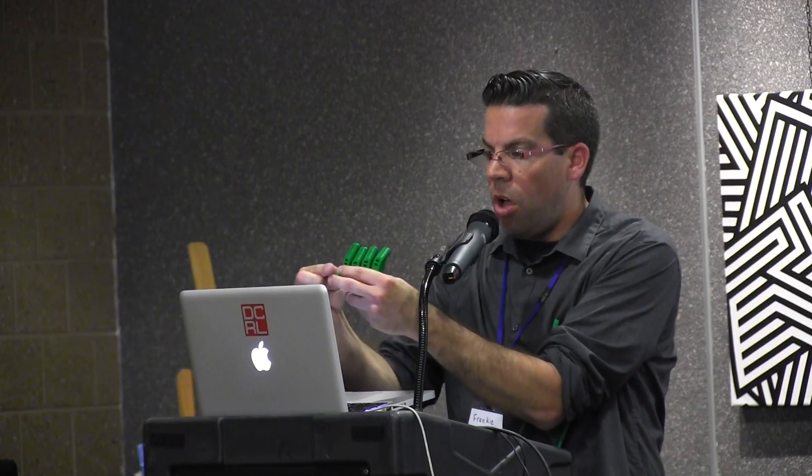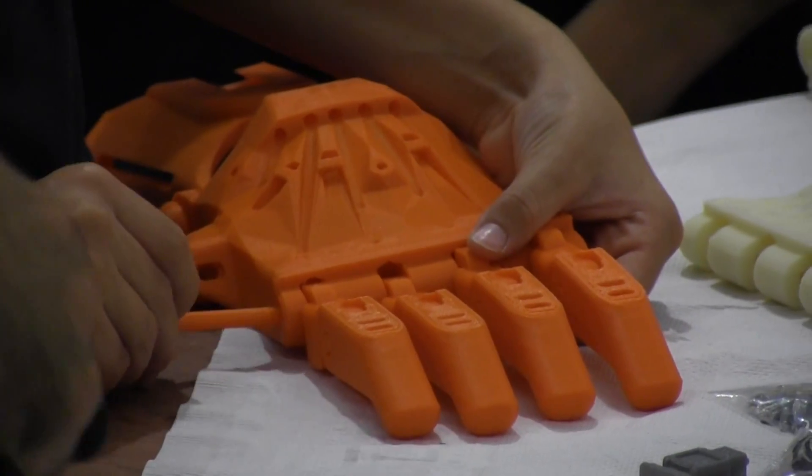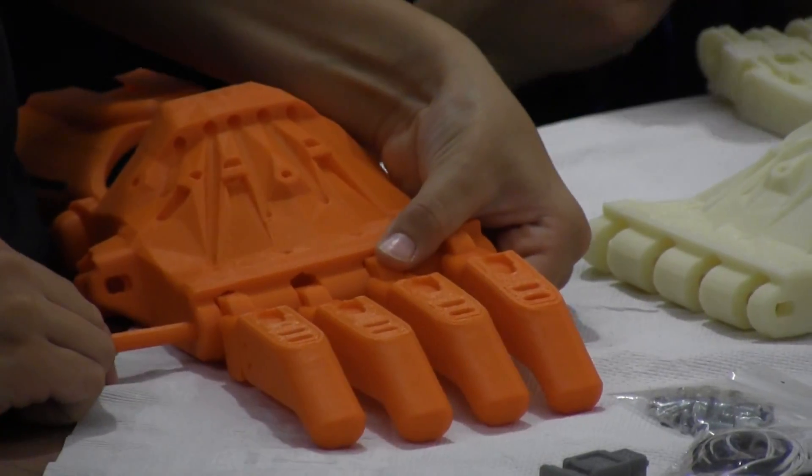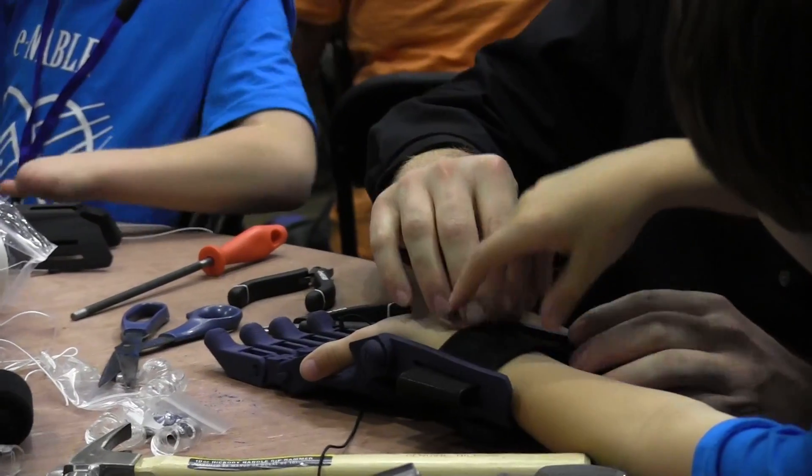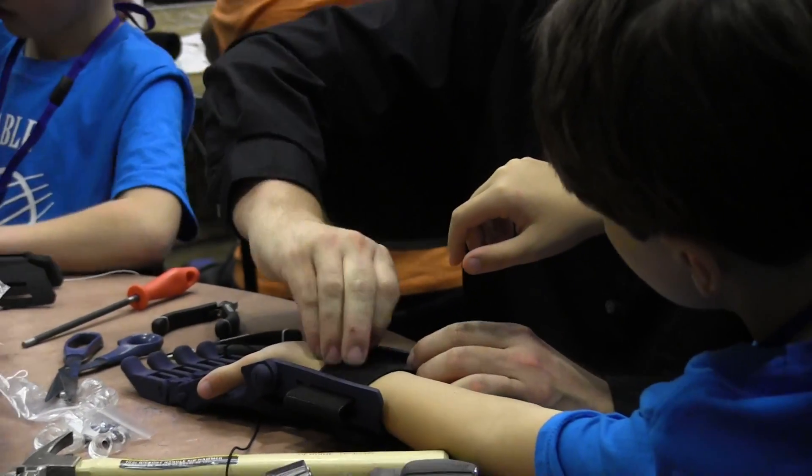You're going to look for two long pins, two long snap pins — they look like this. We had a room full of practitioners learning how to make 3D prosthetic limbs. We're learning right now how to actually put together a hand, which is really neat.